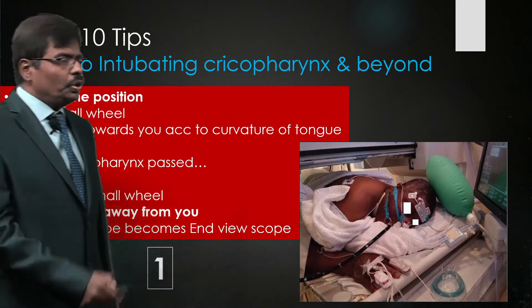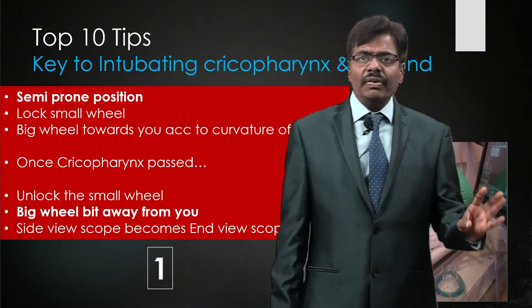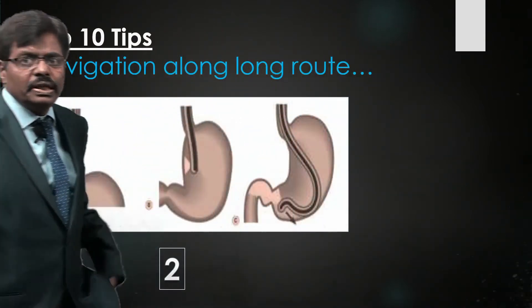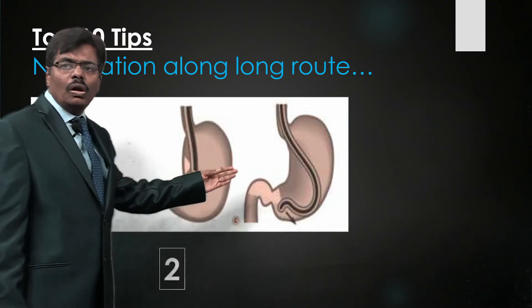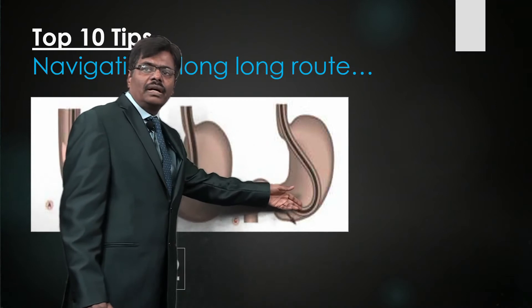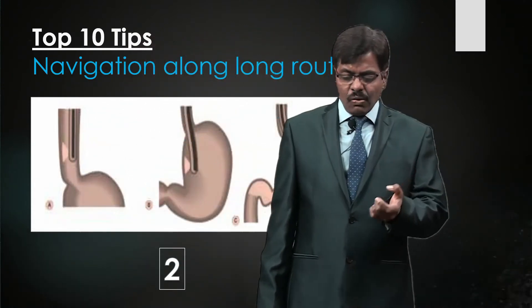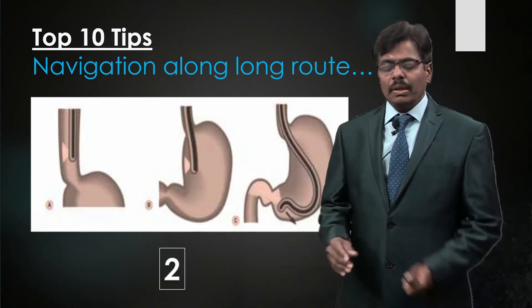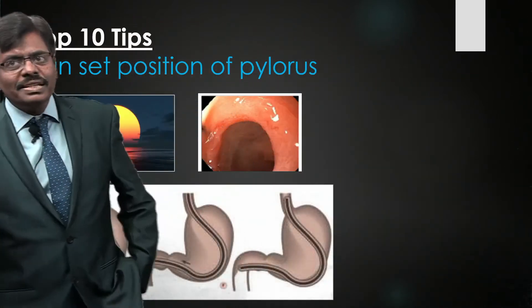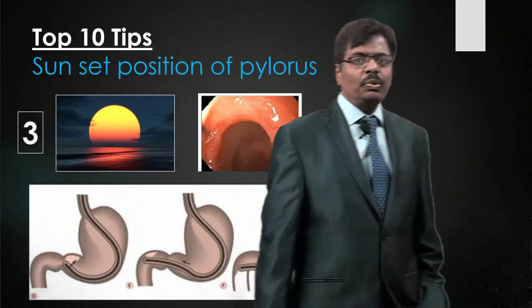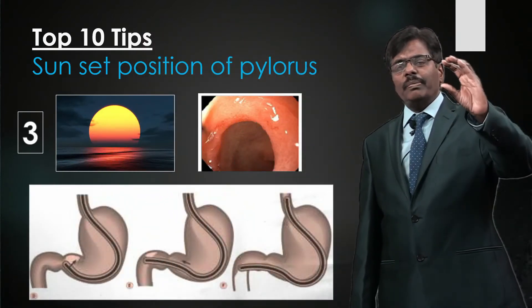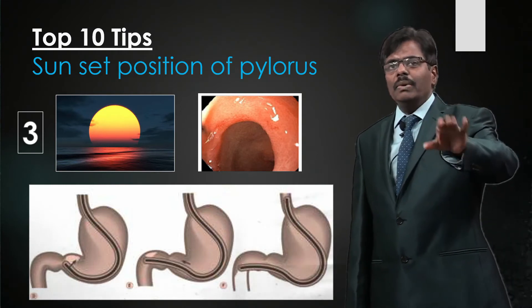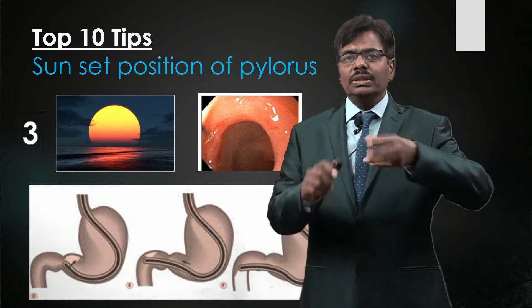These three things will make intubation much easier. What you are seeing is mostly the side wall — you go along the greater curvature, the long route. Then big wheel down and torque to the right — clockwise torque — to see the pylorus in the 'sunset' position: three-quarters of the pylorus visible at approximately 6 o'clock. Straighten the scope and go blindly — another leap of faith — but do not immediately change the wheels; wait until you reach the D1-D2 junction.